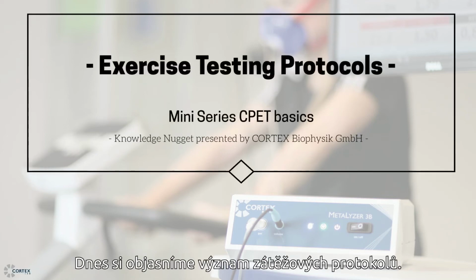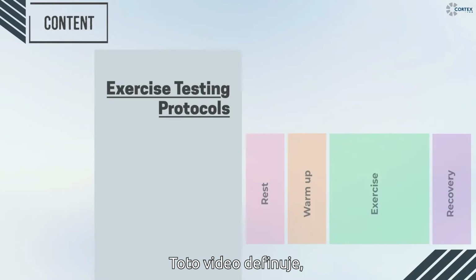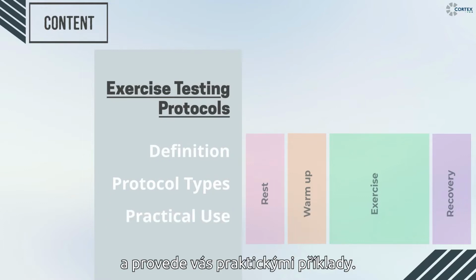Today we will explain and clarify the importance of exercise testing protocols. The content of this video defines what is an exercise testing protocol, it illustrates different types and possibilities of a protocol, and guides us through practical examples.